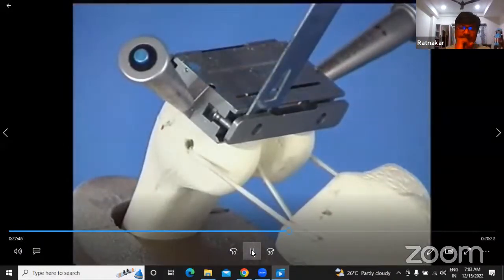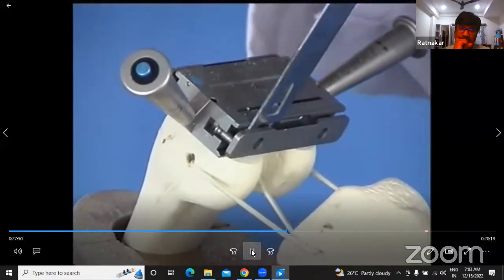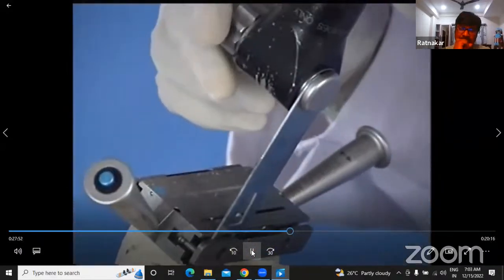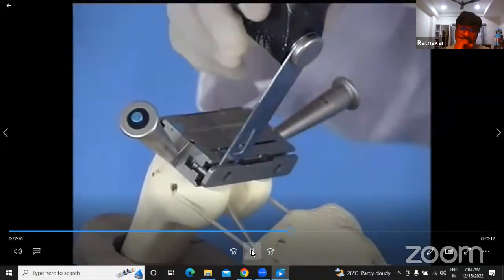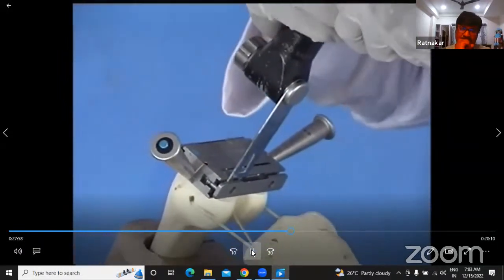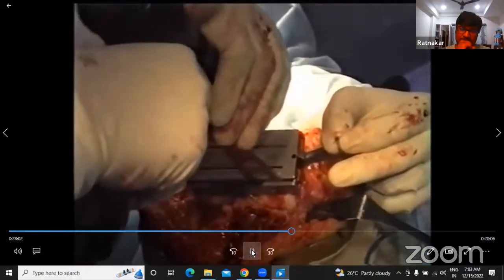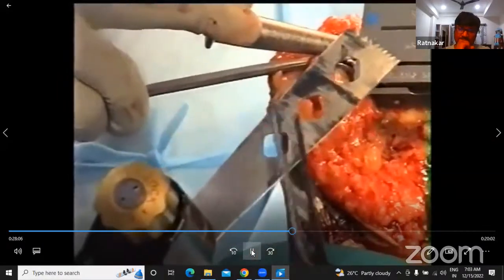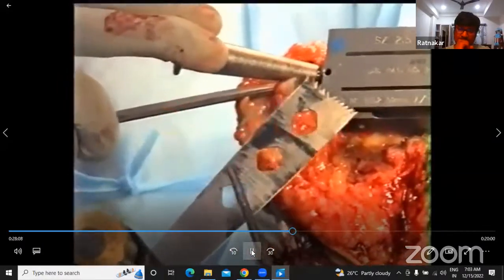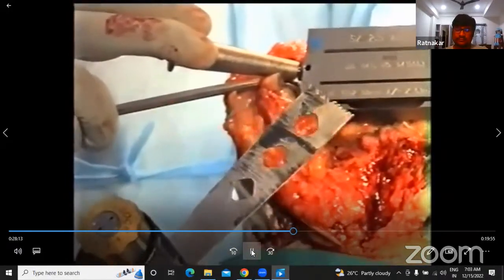Now we are going for the posterior femoral cut. This is a bit delicate cut, and you should be careful. If you are too aggressive or a butcher, your blade might go and hit the popliteal artery. So always you should have two hands control. Posterior femoral cut is very vital. Sometimes if you go further inwards in the popliteal position, you will end up cutting the popliteal artery.